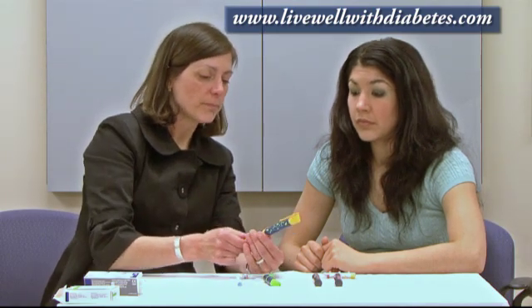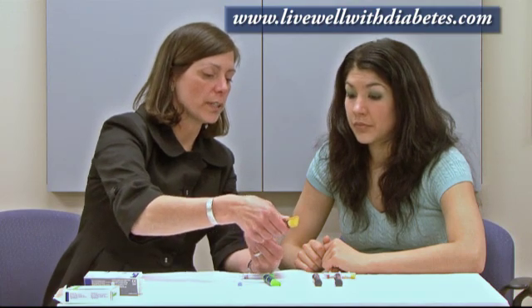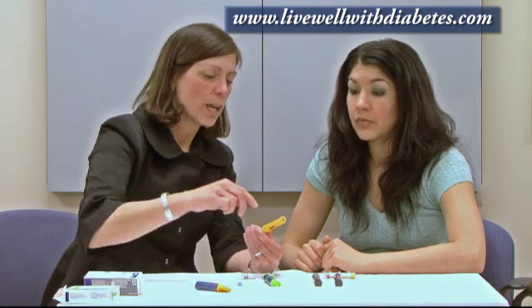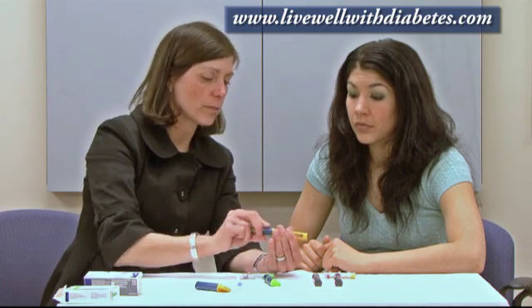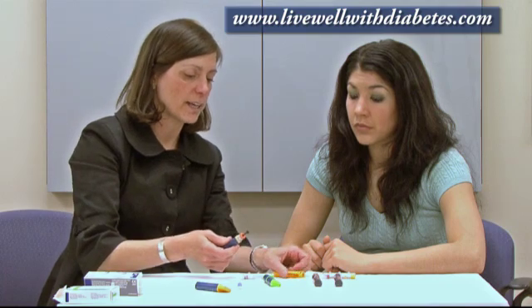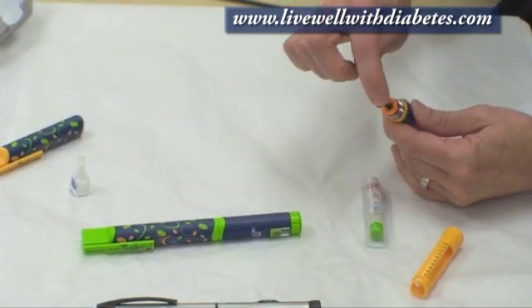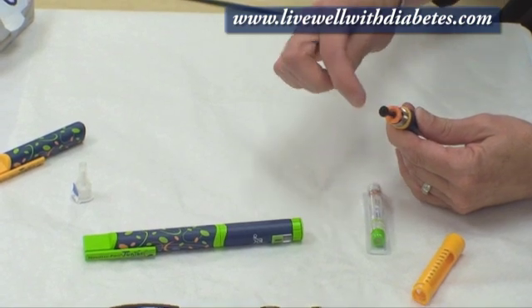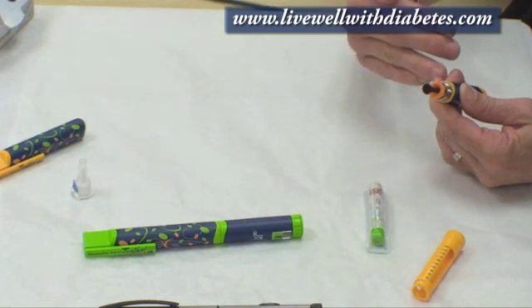I'll show you how to use the junior pen. The junior pen has a lid on it and you just pull the lid off. Then these two pieces come apart by unscrewing. This part is called a piston, and when you're starting to use a new tube of insulin in the pen, you have to retract the piston to its starting position.